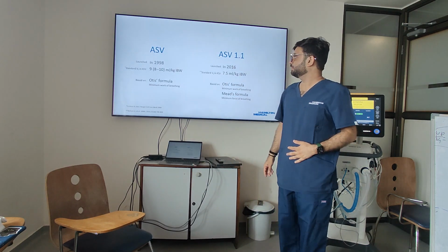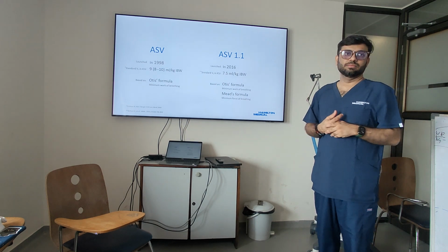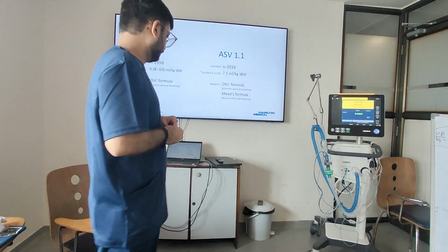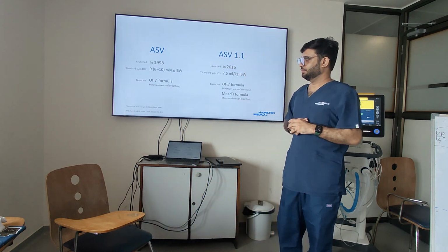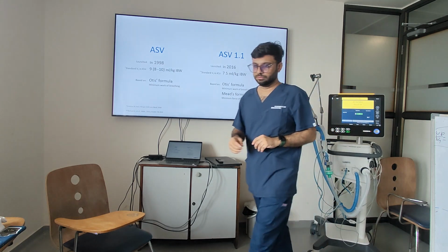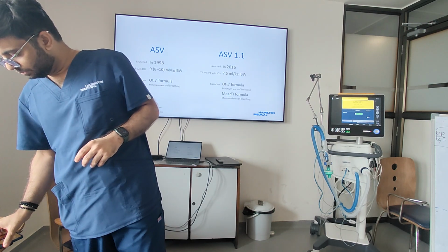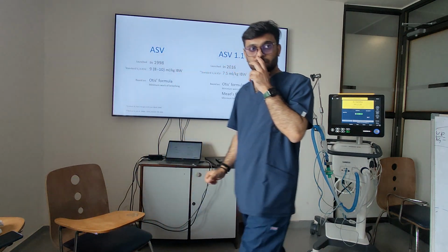When you are increasing the tidal volume now, it's not just increasing your tidal volume in that same inspiration. Your I:E ratio also changes. So if it is 778, you might wonder that 778 goes in 1 second and 3 seconds is expiration. It is not like that. That 778 will be dissipated over maybe 3 seconds of inspiration and 1 second of expiration. You understand? Your thinking is that there is a bulla here and the full tidal volume will go to this bulla. It doesn't occur that way, because it changes the I:E ratio so that it dissipates everywhere. The flow characteristics are changed.